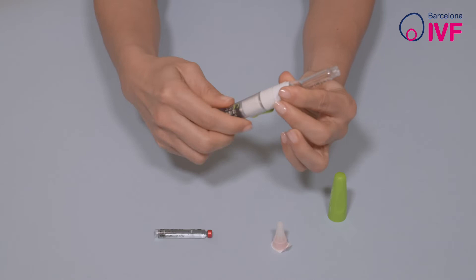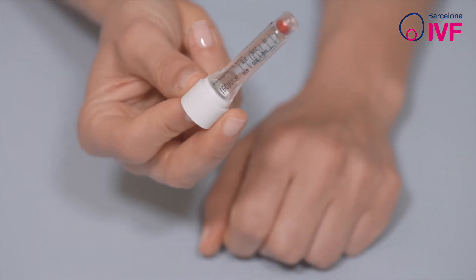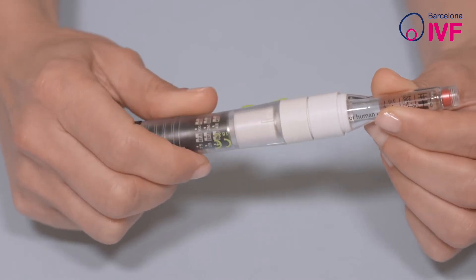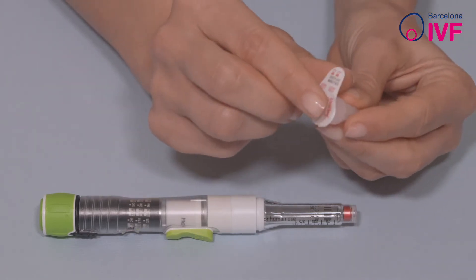Insert the medication cartridge with its top towards the part where the needle will be attached. Screw the two pieces of the pen together, then remove the seal from the base of the needle and attach it to the pen.